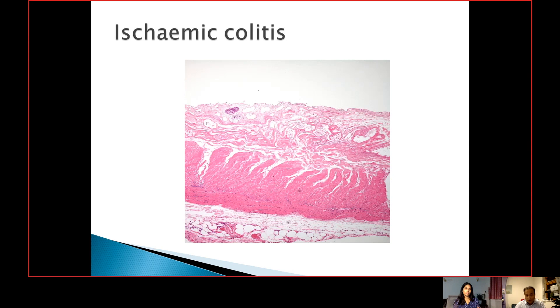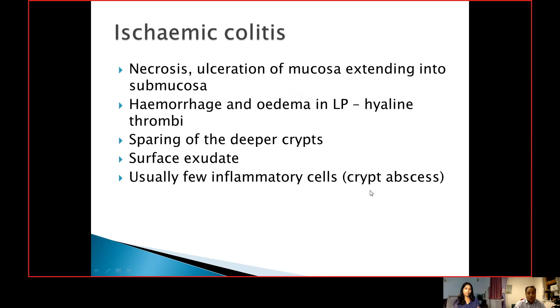Here you can see complete necrosis up to the submucosa — this is the layer of muscularis propria — and in this area you can see a bit of infarction as well. The features to remember are necrosis, ulceration of the mucosa extending into the submucosa, and hemorrhage and edema in the lamina propria. If you're lucky, you can see hyaline thrombi in the small vessels. There would be sparing of the deeper crypts, surface exudate will be present, and usually very few inflammatory cells including crypt abscesses are seen.